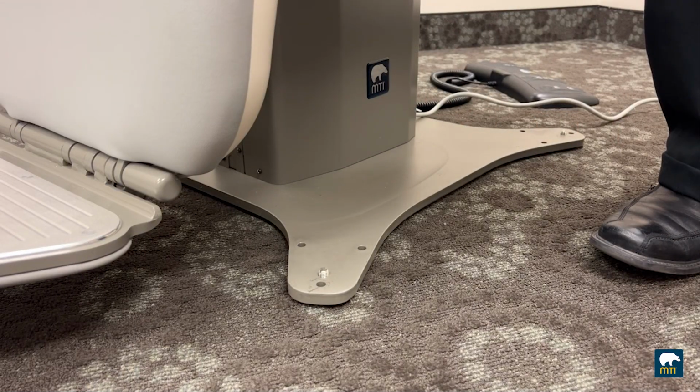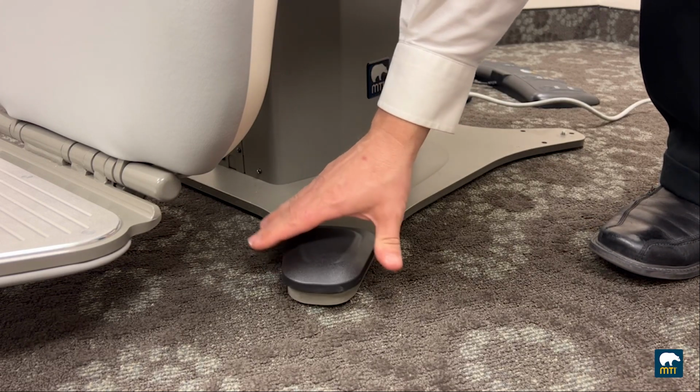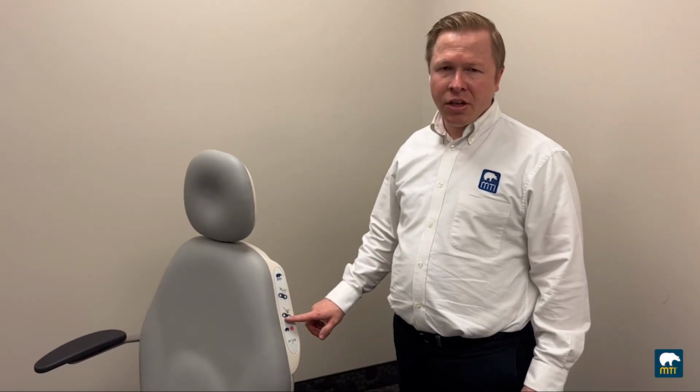Once your chair is level, you can install the leveling glide covers by matching the 3 holes and pressing down firmly. Ensure that each function of your chair works. Note that neither one of the programs will move the chair until they are programmed by the end user. If you ordered any additional accessories, refer to the instructions for installation and operation.